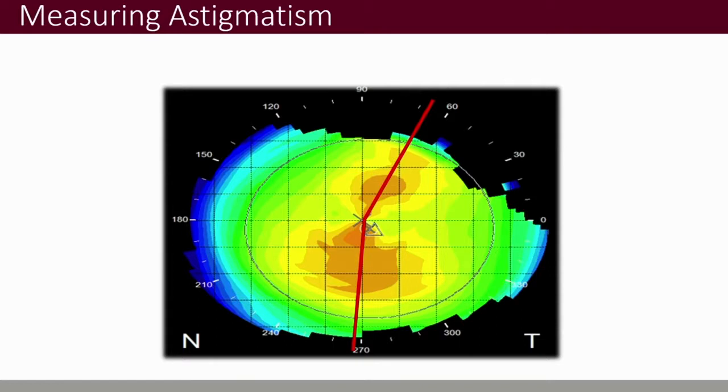So just using clinical acumen, when you look at this, you think, well, I would say that I would line up with the bottom one, because there's more colour there, it's a wider area. The top one doesn't look as influential, so I would line up my toric implant with the lower, inferior half of the bow tie. Well, according to the topography, you'd be wrong, because the topographer's simulated keratometry comes up with 72 degrees, which is actually closer to the superior one.